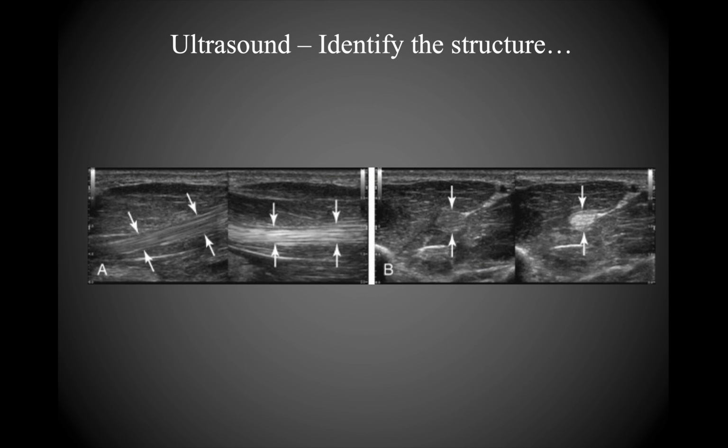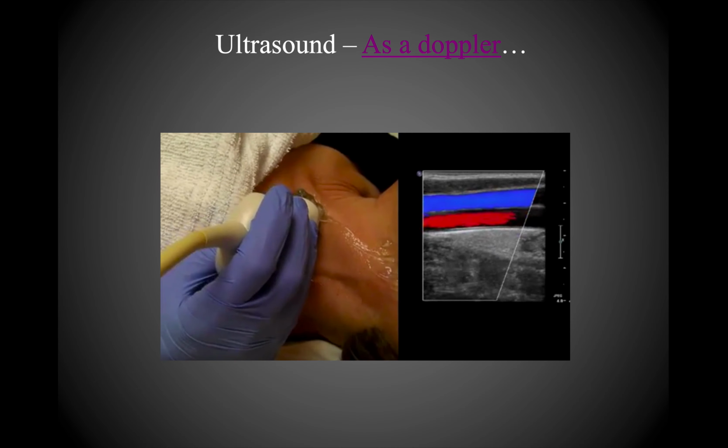on ultrasound. Another way that ultrasound is used is guiding the insertion of needles into the body. That's common in anesthesia. So you'll see that with placing central lines and other lines in the body, and also for nerve blocks, to make sure that you get the needle right up to the nerve and even get it into the epineurium, and be able to make sure that you effectively anesthetize whatever the nerve is that you're seeking to block. So it's another way that ultrasound is commonly used.